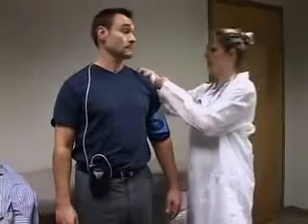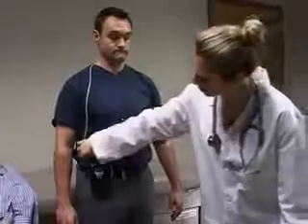Inform the patient that during a reading they should stop what they are doing. If safe to do so, let their arm hang motionless away from their body and avoid talking. During the inflation, check the hose and connections to be sure there are no blockages or leaks.